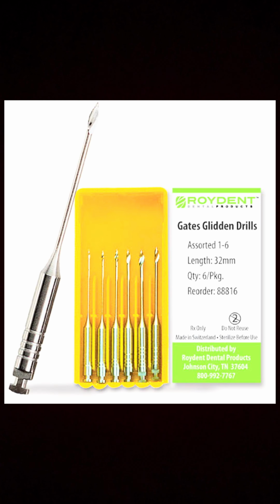It cuts laterally and is primarily used for the preparation of the post space when gutta percha has to be removed from the obturated root canal. Both Gates Glidden drill and Peeso reamer are made of stainless steel and are used with an electric slow speed handpiece in a rotational speed ranging from 800 to 1200 rpm.